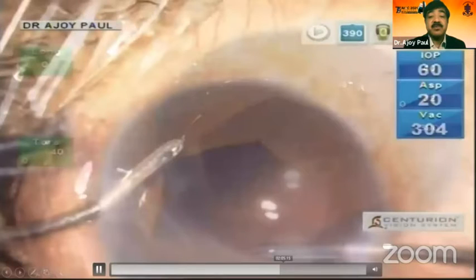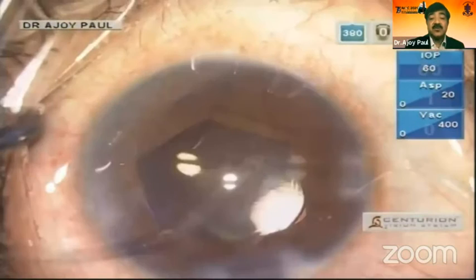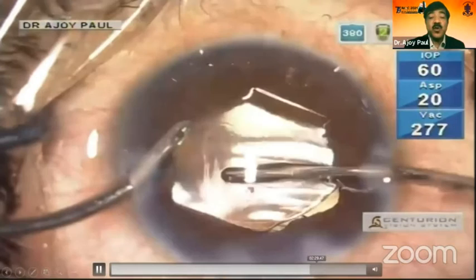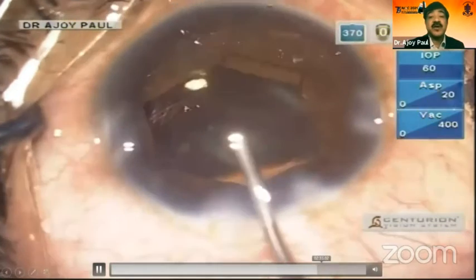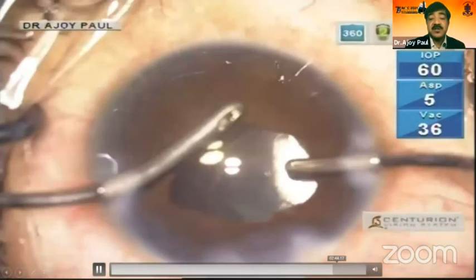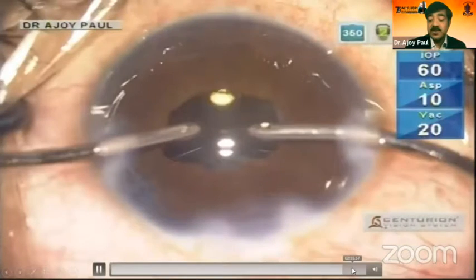And then in this case, I prefer to put in a hydrophobic IOL, an acrylic hydrophobic IOL. Get the visco from behind and above the lens, try to remove as much as possible to lower the chance of inflammation, because this is inflammation prone, and then put visco in front of the lens and remove the lens there. And then at the end of the surgery, I'm just trying to get that back to shape using the IA here, and that definitely gives a good result.